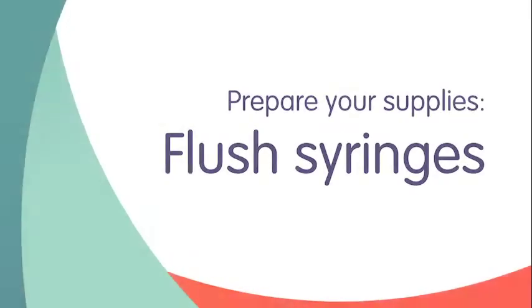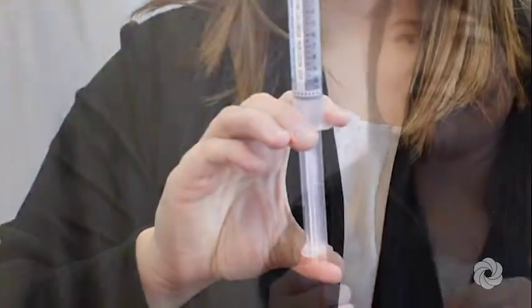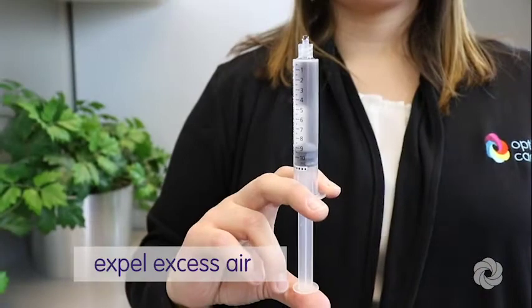Next, prepare your flush syringes. Prior to using syringes, push firmly on the thumb press with the tip cap still on, just until you feel the plunger move. Expel air and excess solution by twisting off the tip cap and pushing the plunger forward.